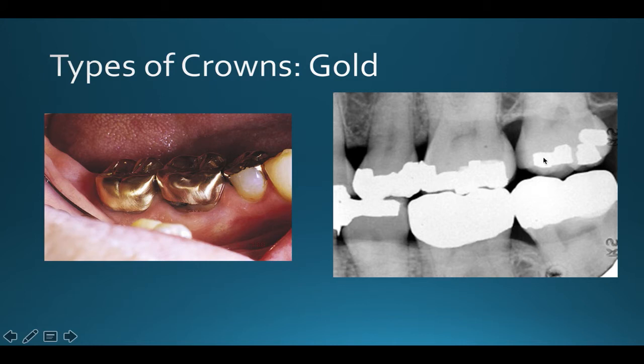Whereas you can see around it, these are all amalgam restorations. I see amalgam restorations, they're jagged. So I see here, this is an MOD amalgam. Here I again have an MO amalgam. Oh, and look here. I can see we have some interproximal caries between these teeth here. Most likely incipient on the distal of 14, and it looks to me like some moderate on the mesial of 15.